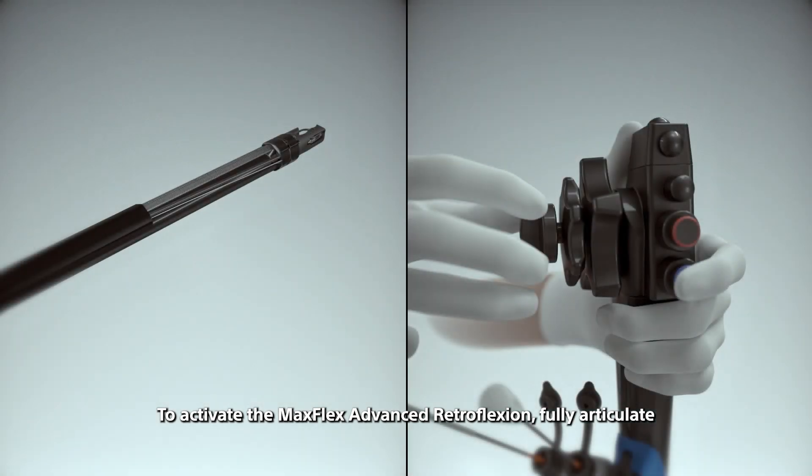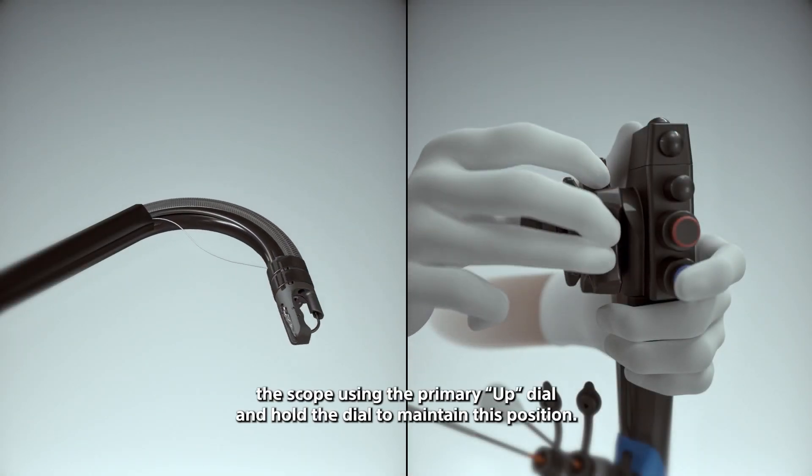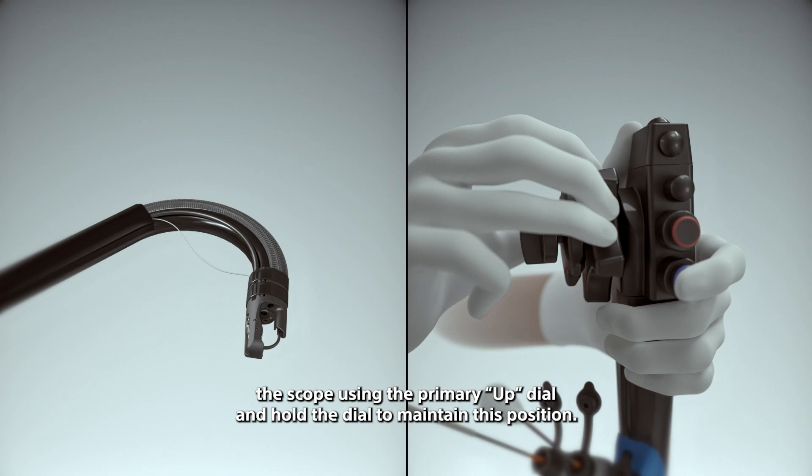To activate the MaxFlex advanced retroflexion, fully articulate the scope using the primary up dial and hold the dial to maintain this position. Do not lock the scope wheel.